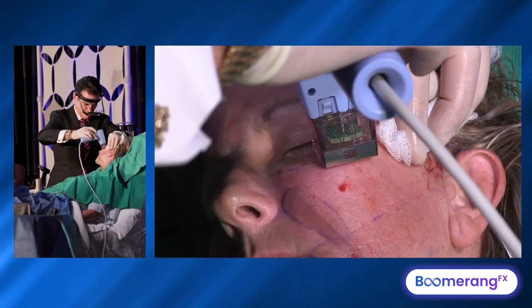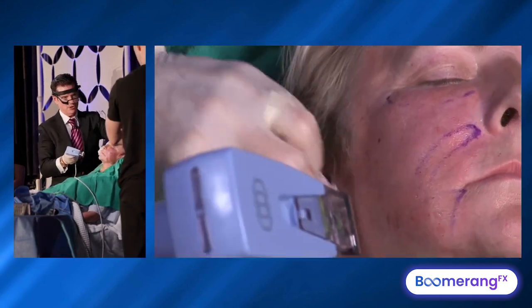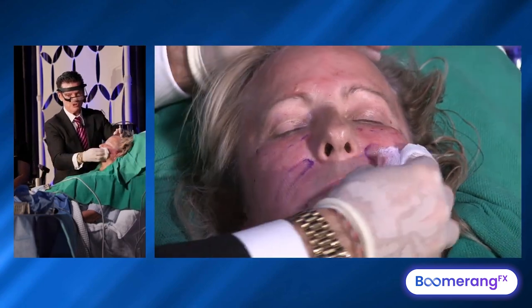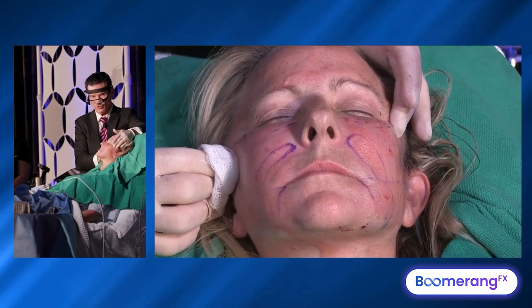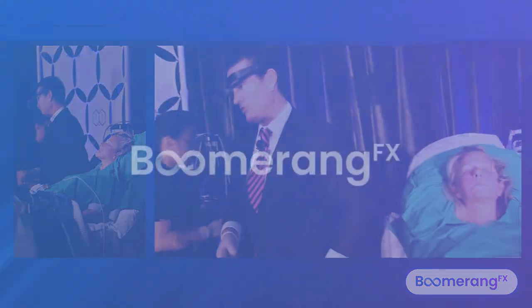We just did multiple-level thermal stimulation. That skin is now undermined. We're going to come back and do a little bit of suspension lift to lift that up and hold it. Before we do that, we're going to add element number two of our rejuvenation process.